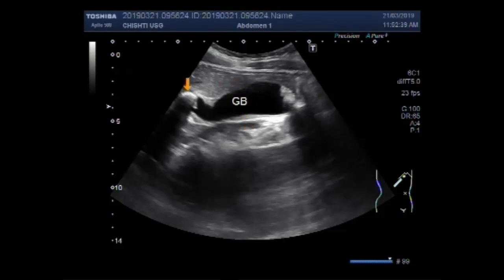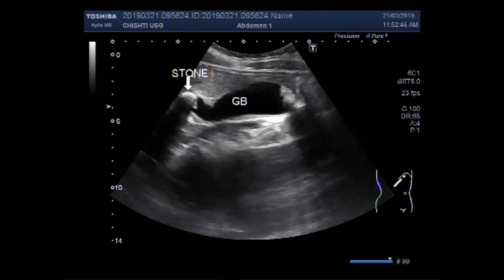This is the gallbladder, and this is a stone. This one is also a stone which is adherent to the fundus of the gallbladder.